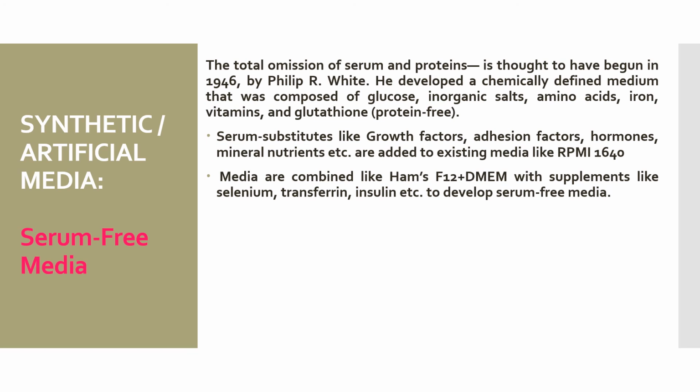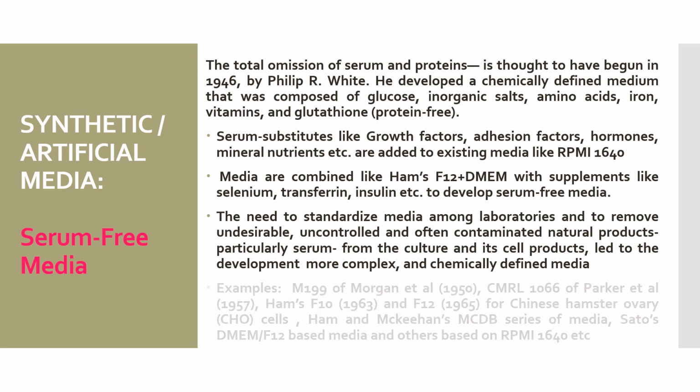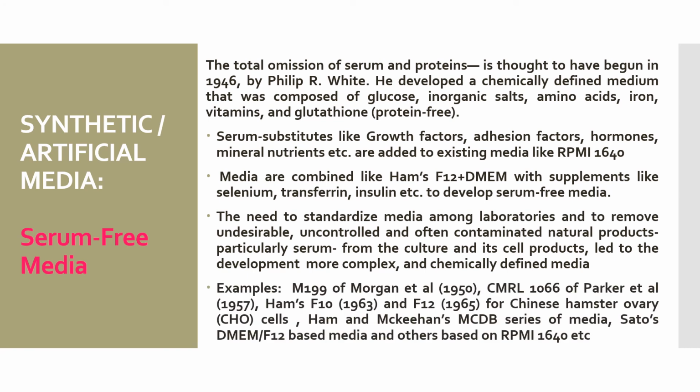Media combined like HAM's F12 with Dulbecco's modified Eagle's medium with supplements like selenium, transferrin, insulin, etc. to develop serum-free media. The need to standardize media among laboratories and to remove undesirable, uncontrolled, and often contaminated natural products, particularly serum, from the culture and its cell products led to the development of more complex and chemically defined media.